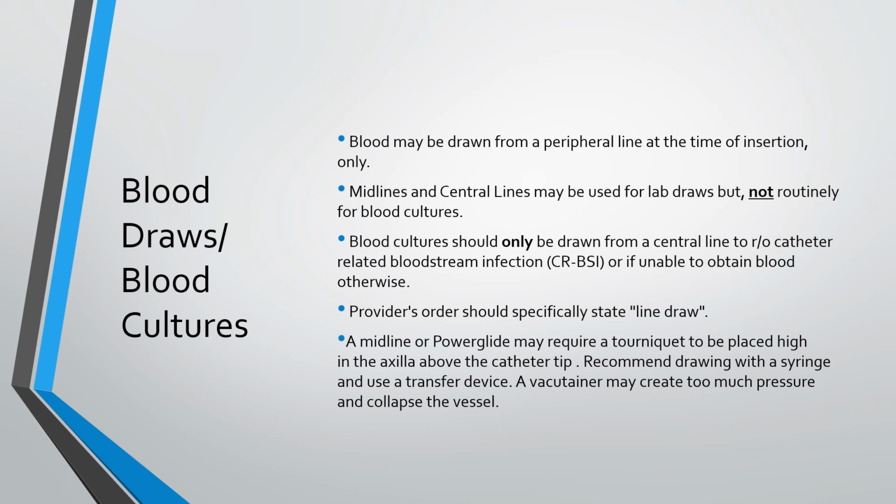Blood draws and blood cultures. Blood may be drawn from a peripheral line at the time of insertion only. Midlines and central lines may be used for lab draws, but not routinely for blood cultures. Blood cultures should only be drawn from a central line to rule out a catheter-related bloodstream infection or if absolutely unable to obtain blood otherwise. A provider's order should specifically state line draw.